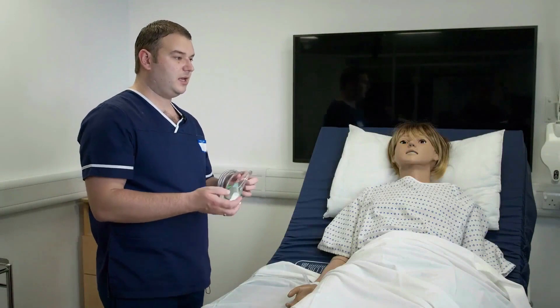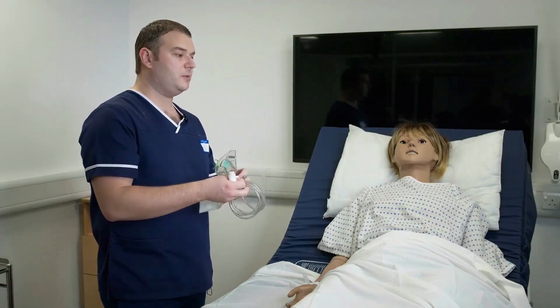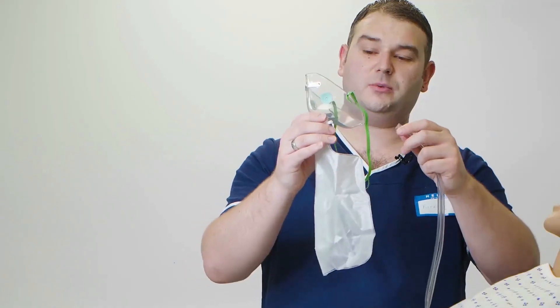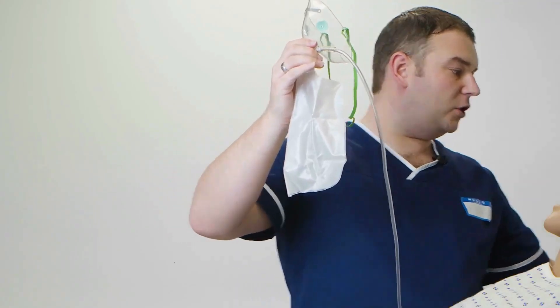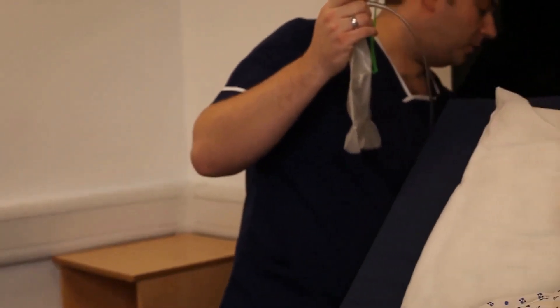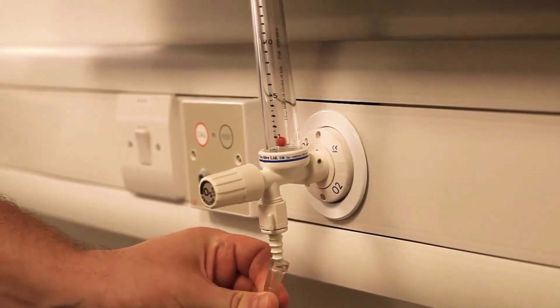Next I will assemble the kit together and attach it to the oxygen flow meter behind the bed. We will attach the tubing to the side of the oxygen mask and then attach the tubing to the flow meter at the wall, and turn on the oxygen to 15 litres per minute as per the prescription.